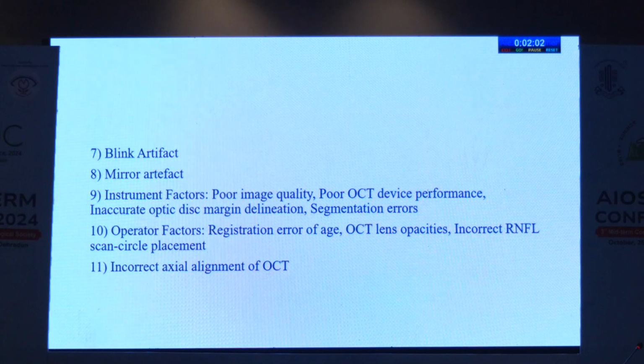And blink artifact and mirror artifact, these are the OCT factors which will cause error. And the latter are the instrument factors, the operator factors, and incorrect axial alignment of the OCT.